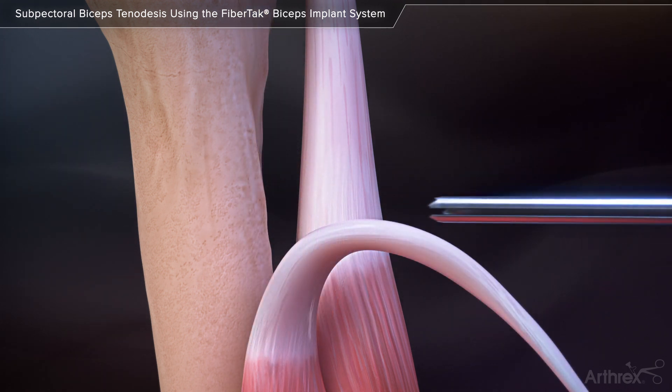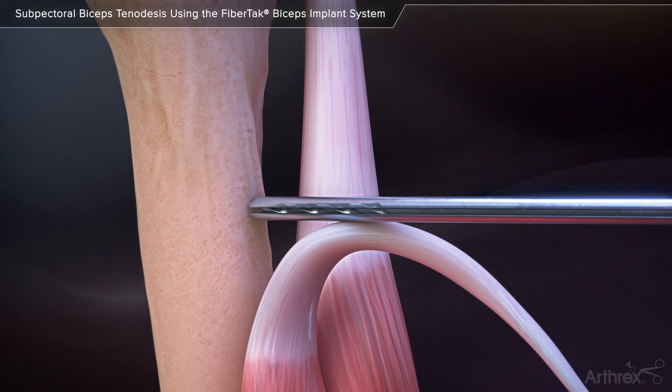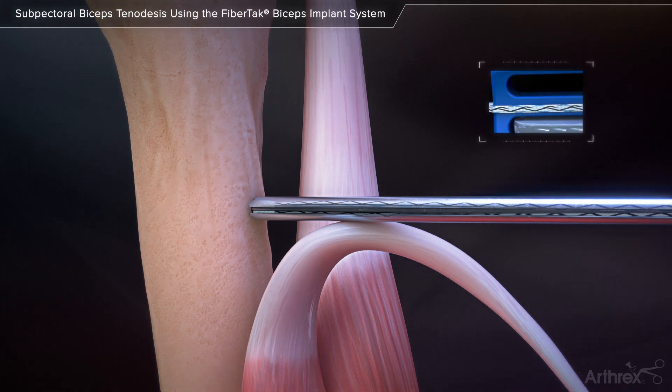Place the FibreTac biceps drill guide at the desired location on the bony surface of the proximal humerus and drill a unicortical hole with the 1.9 mm FibreTac biceps drill. Keep the drill guide in place and insert the FibreTac biceps implant through the guide.